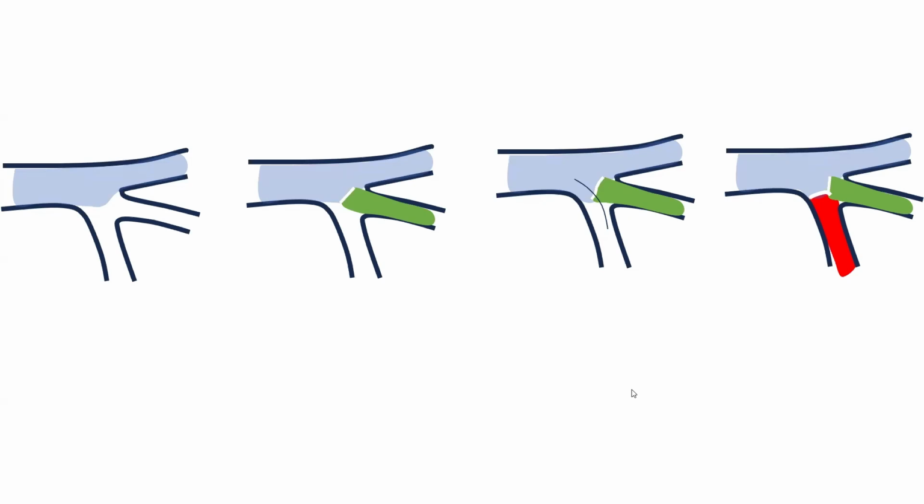Very little metal overlap compared to doing double DK crush or even combined DK crush and TAP. Same nice streamlining of stent layers will happen if you are stenting the LAD and the left circumflex, and you'll have one stent layer across the ramus if it needs to be rewired. I will move on now to show two cases that I came across recently.